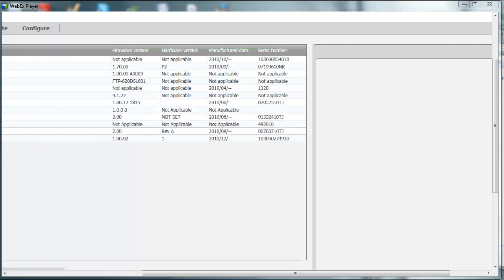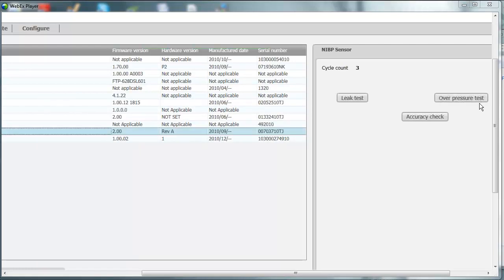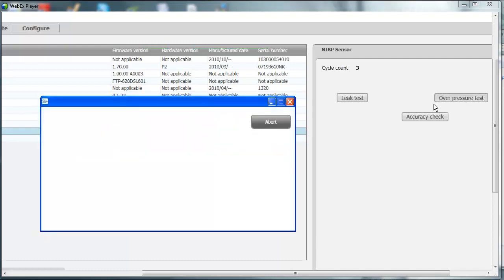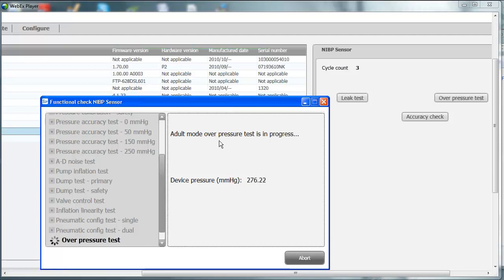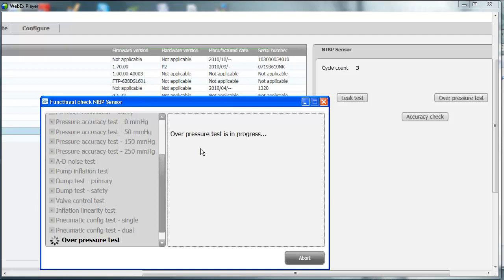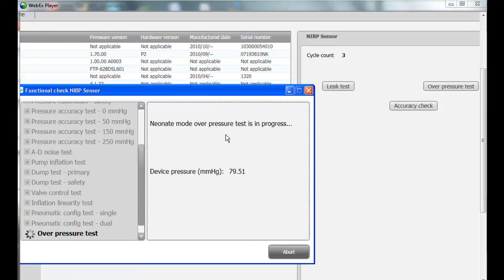Click Close. Next, click on the NIBP sensor and perform the overpressure test. It states to connect to the 500 cc test volume. Click Next. This test will pump up to 329 millimeters of mercury. This is a safety check to ensure the cuff does not inflate beyond 329 mmHg, so it does not cause patient harm or discomfort like bruising. It does this for adult mode and neonate mode. The test triggered at 297 mmHg in adult mode, so it passed. Neonate mode should trigger around 140 to 165 mmHg — it passed with a green checkmark.